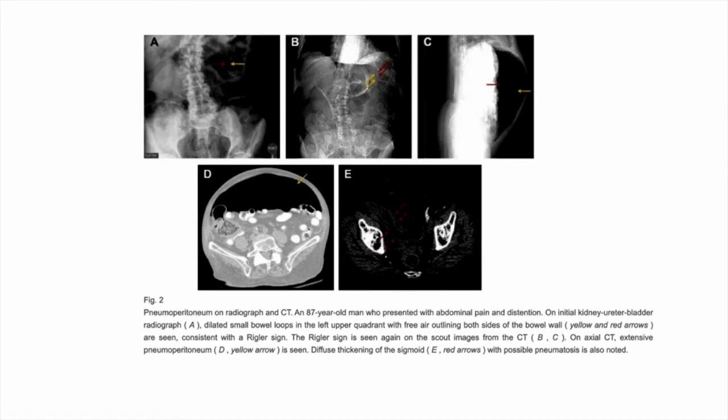In this case, abdominal X-rays and CT scan of the abdomen. So you have to look at it very well, and remember, always suspect in this kind of diseases.